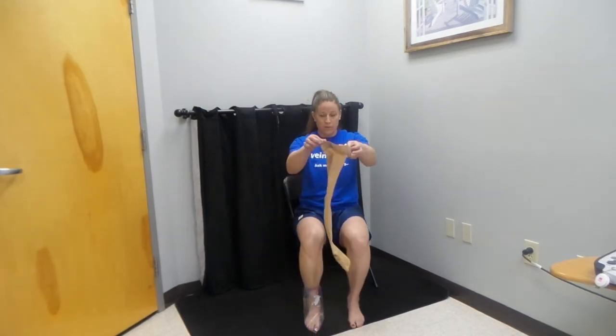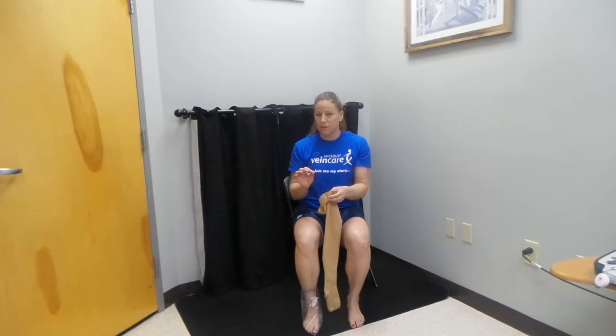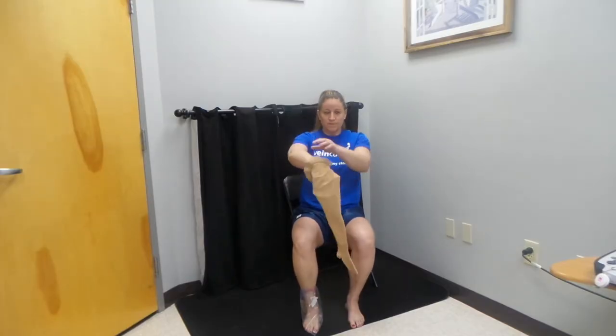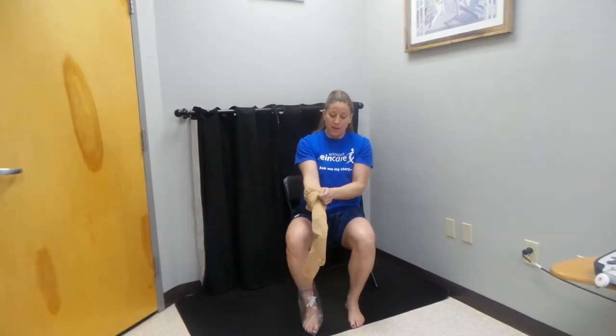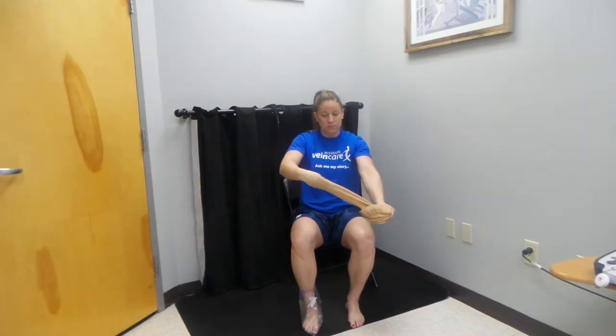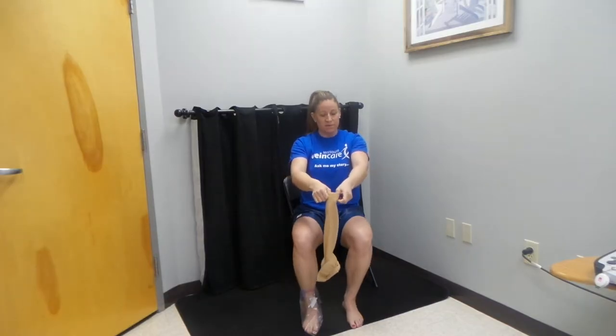Now we're going to grab our stocking. When you stand up to do this, make sure you're careful because that plastic bag can be a little slippery. Like all compression stockings, we're going to stick our hand inside of the stocking, work it down until we get to the heel, and pinch the heel. We need to turn it so the heel is at the top and the rest of the stocking is inside out, with the bottom ready to be slipped onto our foot.